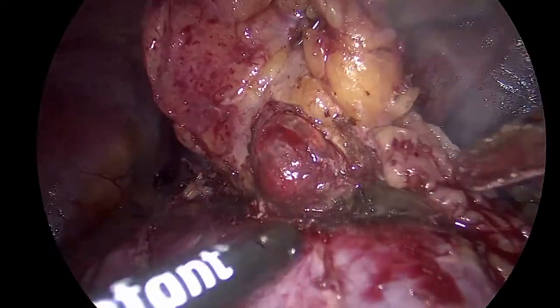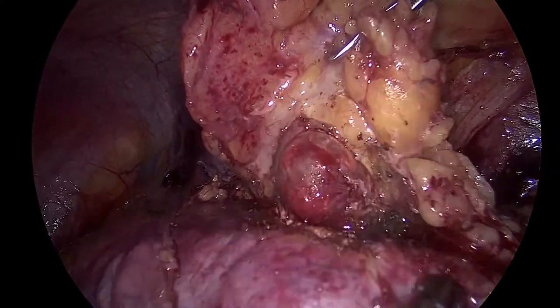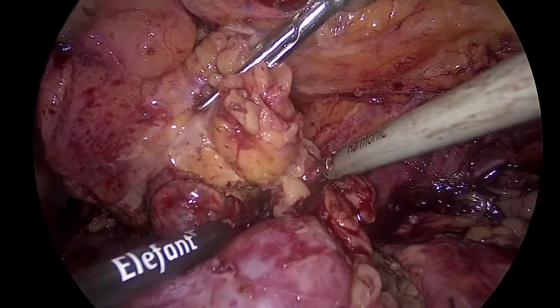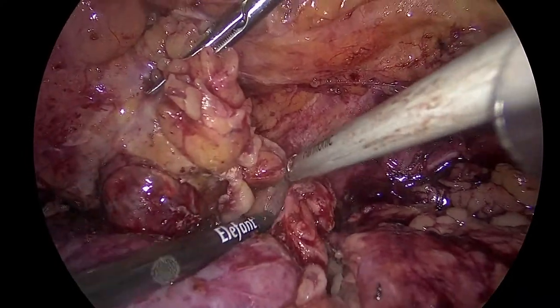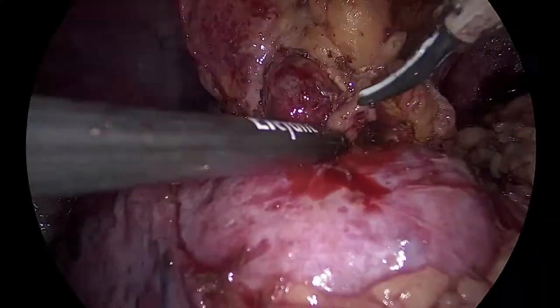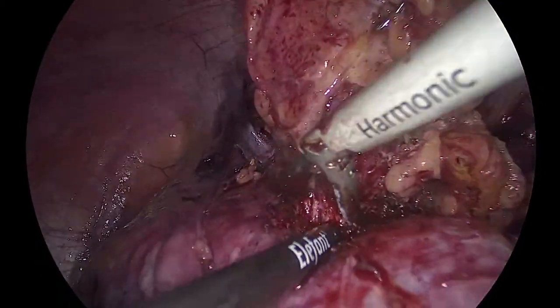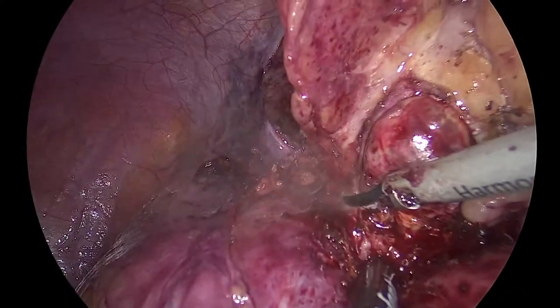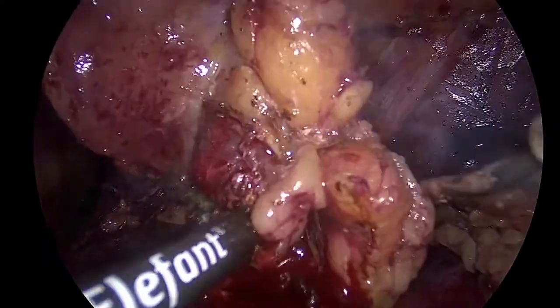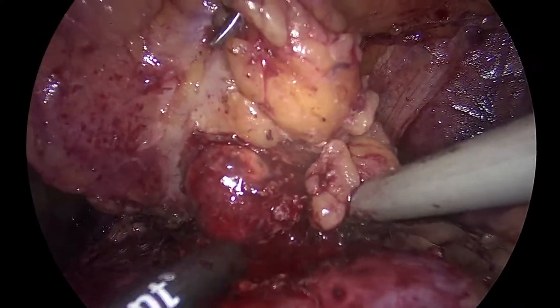Looks like the tumor here, eh? Okay. Yes. Go back a bit. Okay, good. Come in. Good. Show me here. Show me. Come in. This side. Gone. Small, eh? You see how nicely it looks?